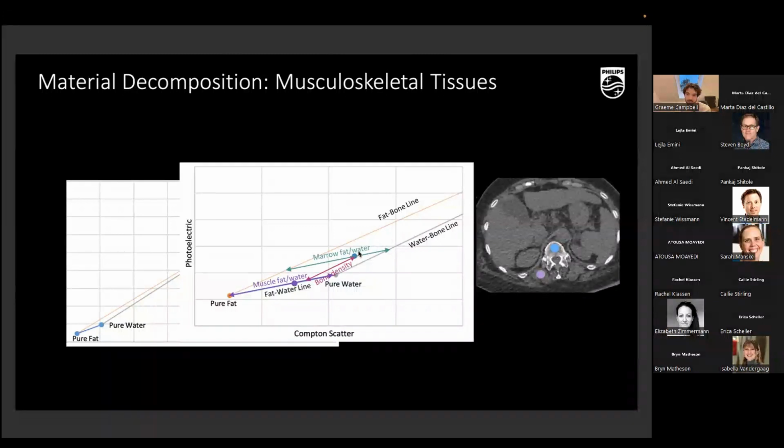So for example, if I'm looking at a fracture in bone, maybe healthy bone is probably more fatty, so it's around here, but as edema comes in, there's an acute fracture, this point will move over, even if the bone mineral density doesn't change that much. BMD, I'm not as much concerned about the marrow fat if I'm only looking at BMD, and then I can look at how long this is, but maybe I'm concerned about marrow fat because we know that will also affect bone health, and I can look at that here.